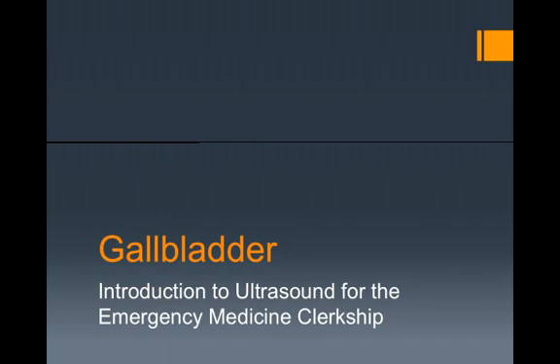Today we will be discussing bedside imaging and the evaluation of right upper quadrant abdominal pain. As we will soon see, gallbladder disease is well suited to emergency ultrasonography, as presence of findings upon the exam, taken with the clinical picture at large, can lead to a confirmation of a presumptive diagnosis of acute cholecystitis or rapidly narrow the differential.